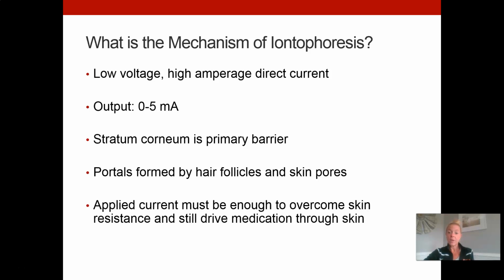And so some people tolerate it really easily, some people don't. And just because you tolerate E-stim well and like E-stim doesn't necessarily mean you're going to like Ionto, and vice versa. So it's kind of hard to tell who's going to really be able to tolerate Ionto up to its maximum output, and who will not.